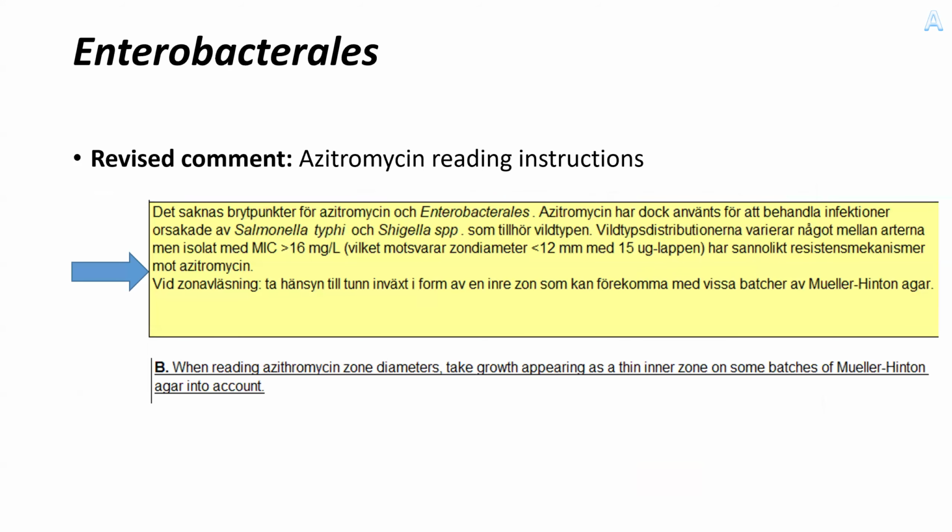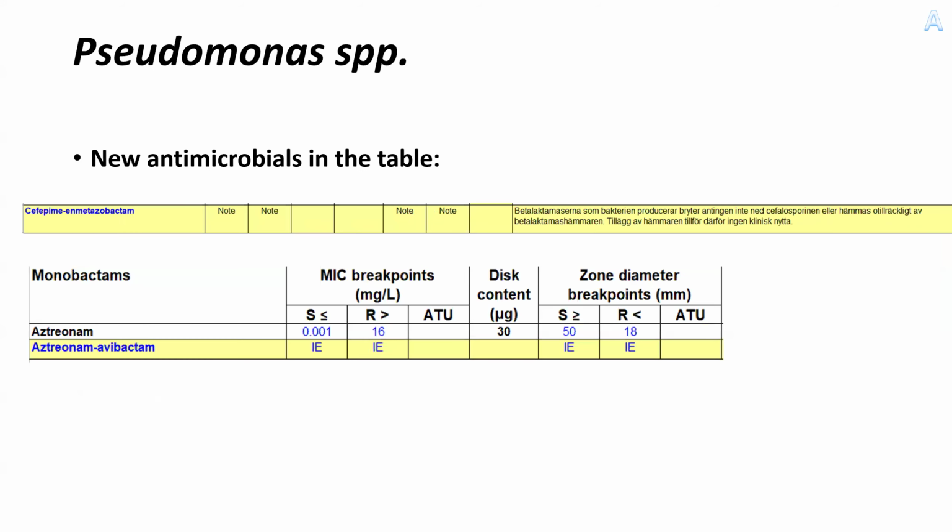Yes. I would also like to mention that for the Enterobacterales, there's also a revised comment regarding reading instructions for azithromycin. It states that when you are reading the azithromycin zone diameter, you have to take growth appearing as a thin inner zone into account. Yes. The next one.